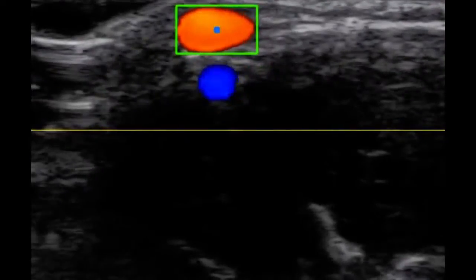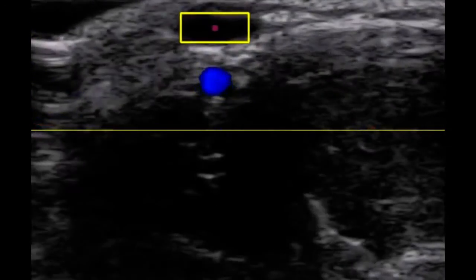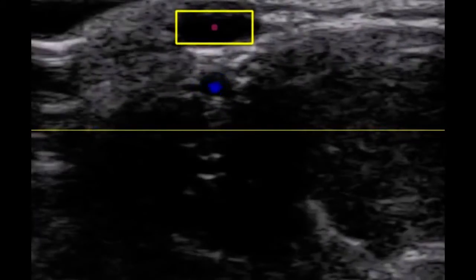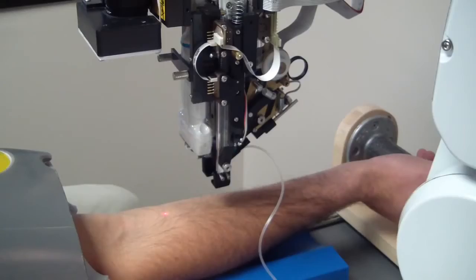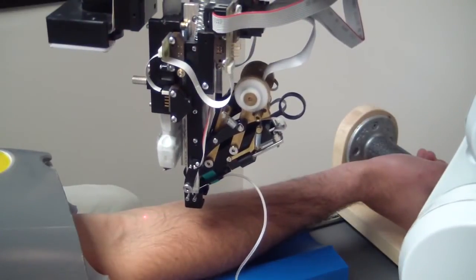Once the V-Bot system selects a target vein, it turns to ultrasound to confirm that the selected vein has sufficient blood flow for a successful blood draw. The robot then aligns the needle and sticks it in. The whole process takes about a minute.